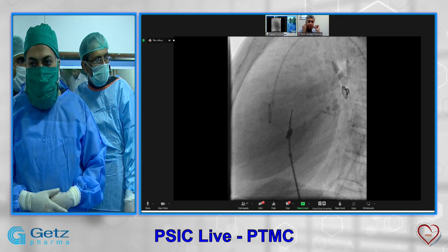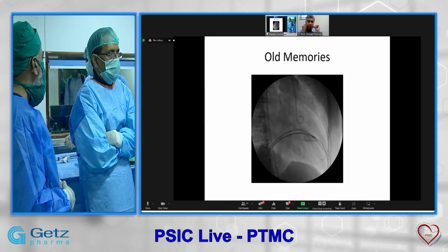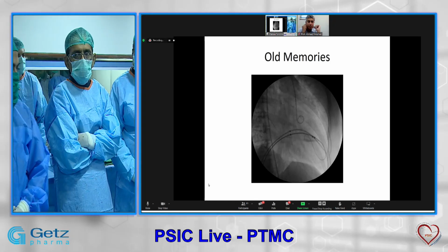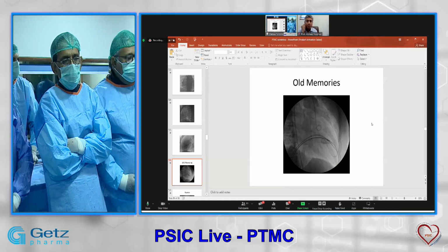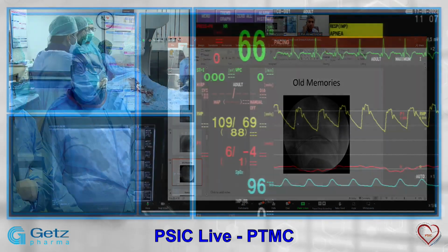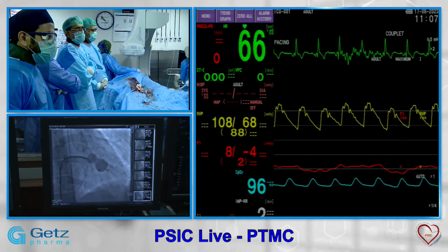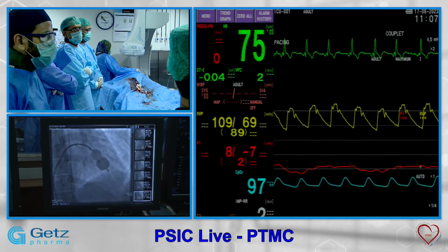Okay. Thank you, Dr. Naveedullah sir, for comprehensive basics followed by a clean procedure and excellent results. Some talk about the complication. As you see, the patient had a valve area of 0.7, now it has increased to 1.6. The PA pressure was 85 to 90 at the start, that is down to 50 millimeters of mercury.